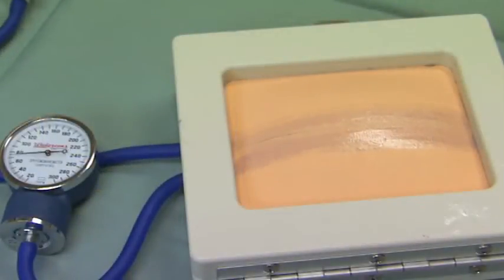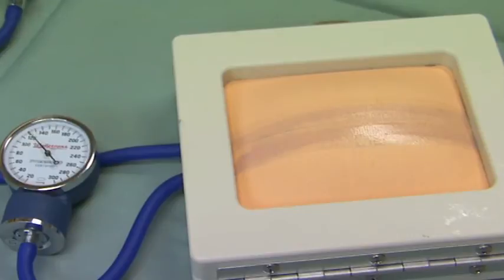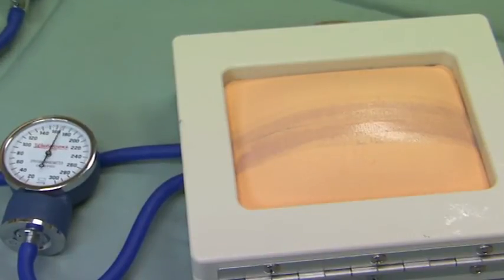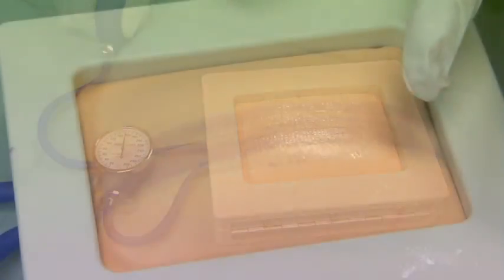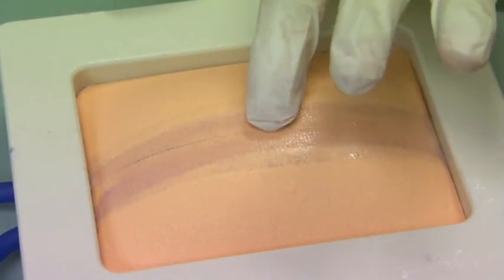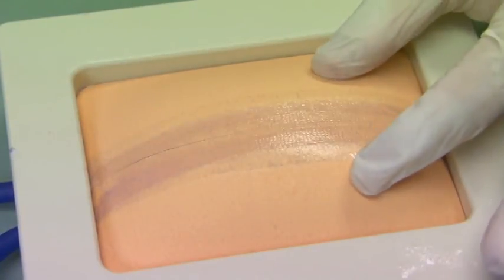I'll inflate this up to 150 millimeters of mercury. That's quite a bit of expansion, and you can see how nicely this holds. This provides a nice strong closure to our wound edges with no gapping of our incision.